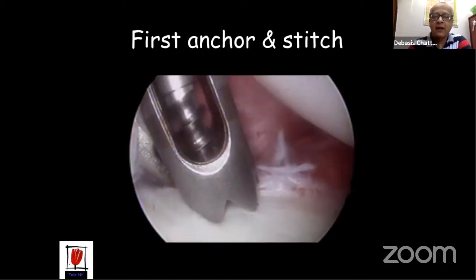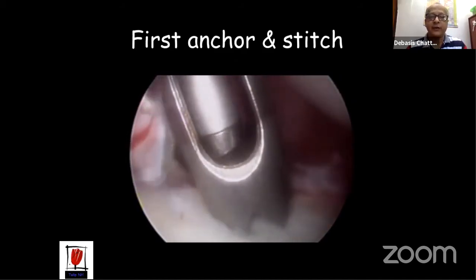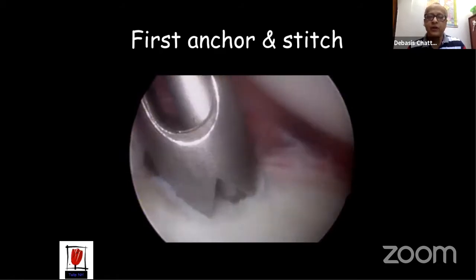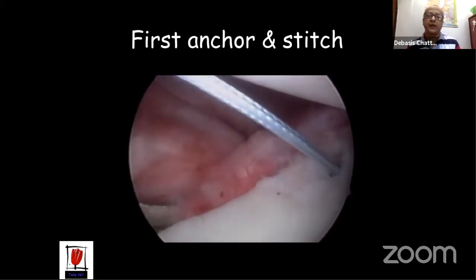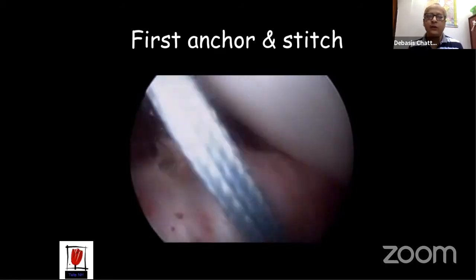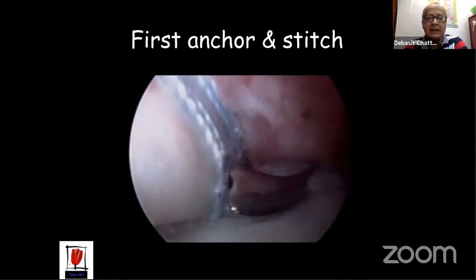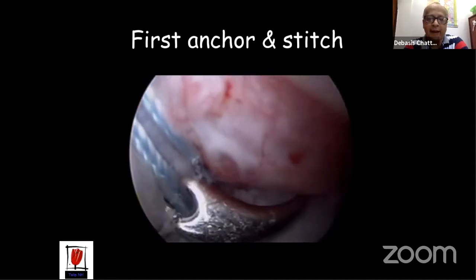Once you have done that, now is the time for placing the first anchor. This is one of those so-called fast-tack anchors, one of my favorites at one point of time, because you don't need a drill. You can push them directly through a sleeve. You push them into the correct position. And once the anchor is placed, of course, we now use mostly all-suture anchors. Then you take a bite into the capsule using different instruments. I'm using a clever hook here, one of those antegrade instruments. And you take a bite of the capsule in the appropriate place and grab one limb of the placed inferior anchor.